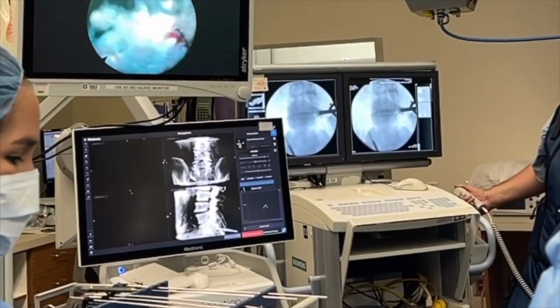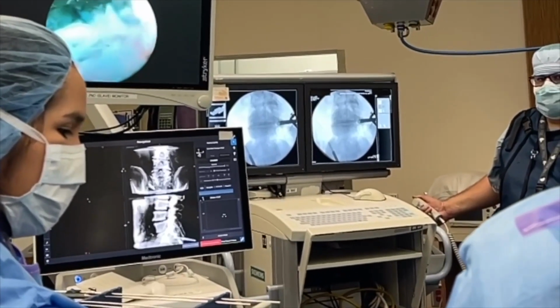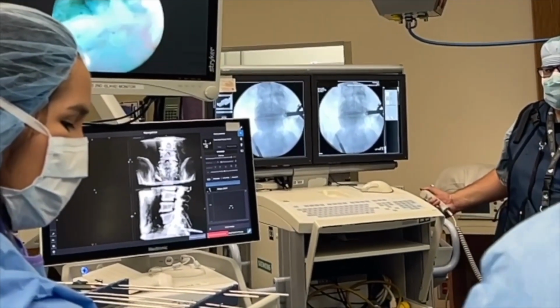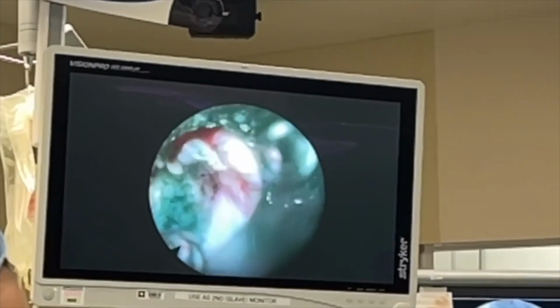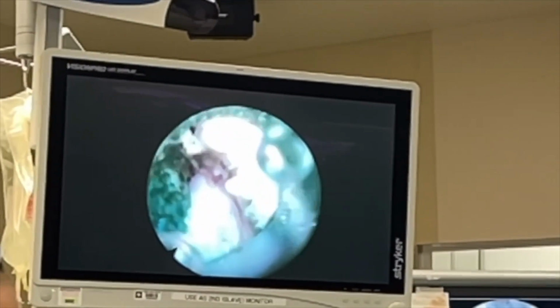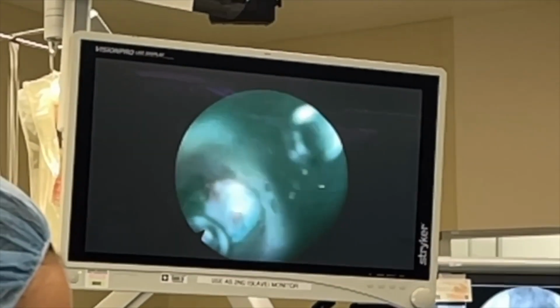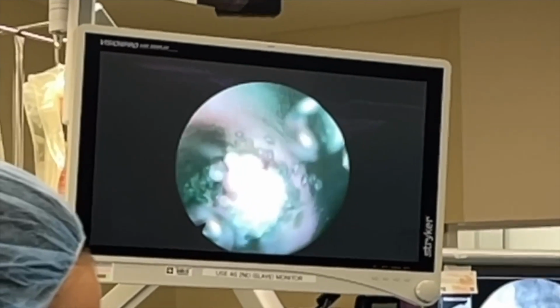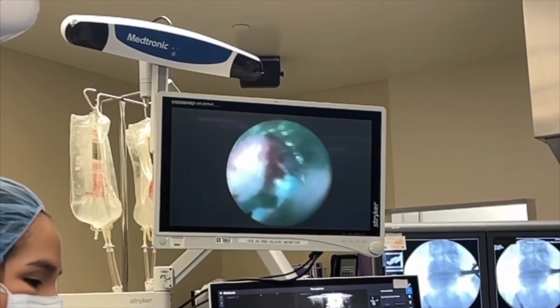All right, I'm going to look around now because I think I have done some excellent decompression, I hope. There it is. Look away. Oh, yes. And there's the lateral aspect of the facet joint.